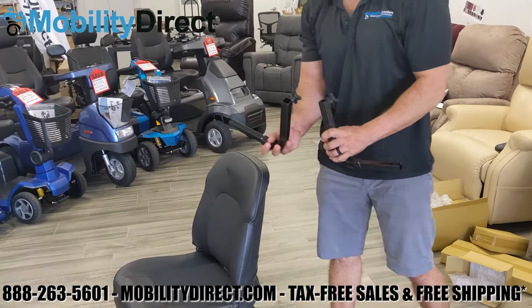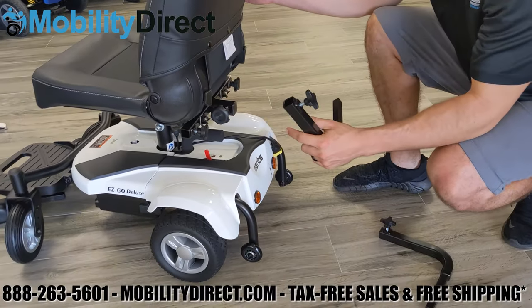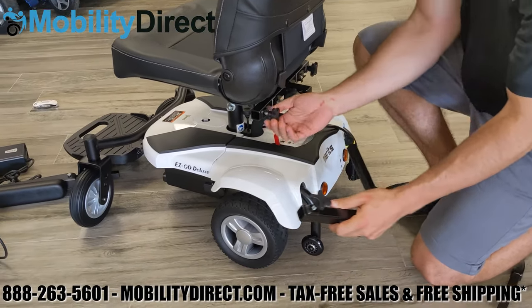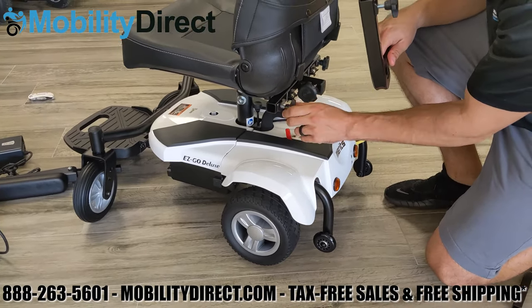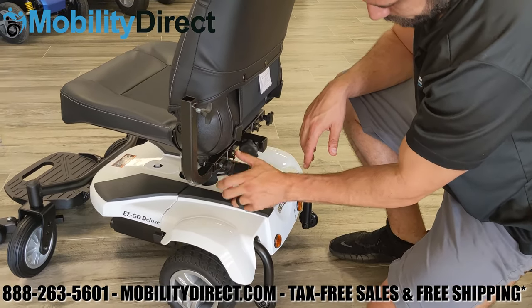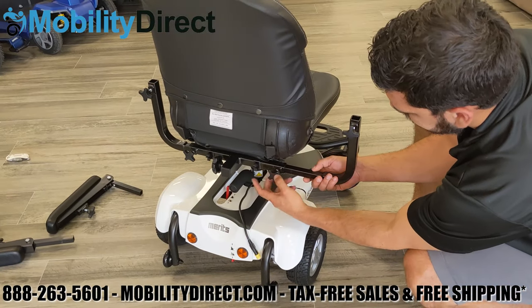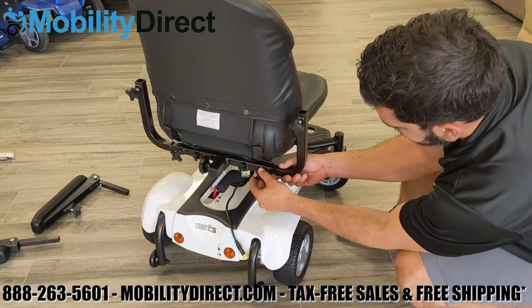The next thing we're going to do is grab the 90-degree armrest brackets. They will slide into the sleeves located on the back part of the seat. You'll see the tension adjustment knobs, which we're loosening here so that we can slide the 90-degree rail into the sleeve. Once it's in, tighten that knob and repeat on the other side.